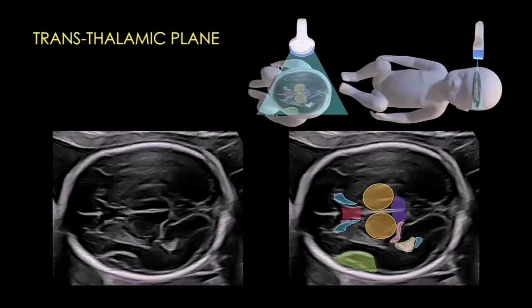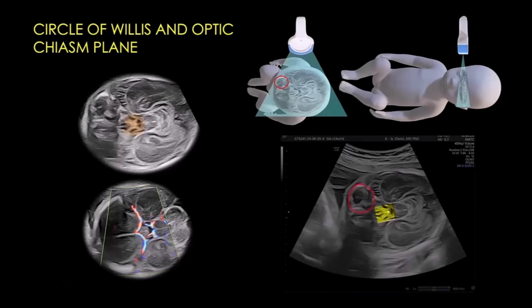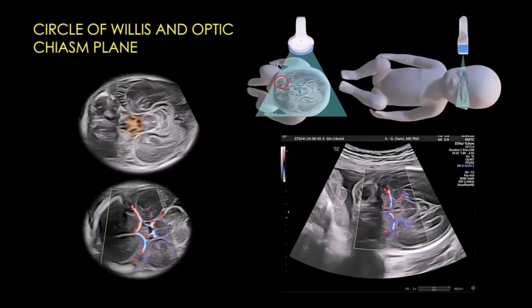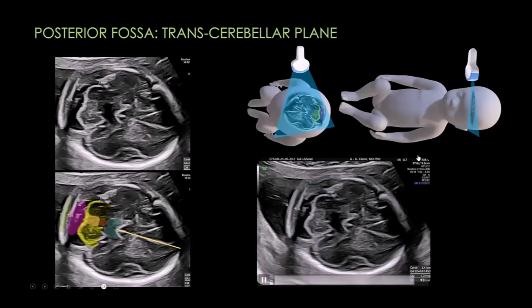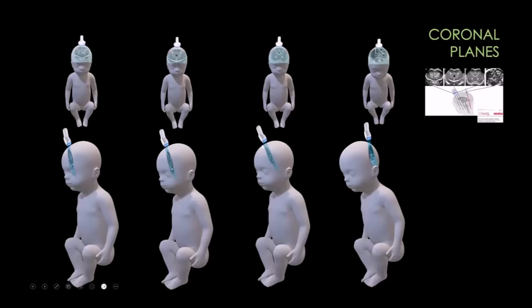We are proud to present Fetal Anomaly Scan, a comprehensive step-by-step guide to second-trimester ultrasound, a complete online course designed for clinicians and sonographers who want to strengthen their practical approach to prenatal ultrasound. This training package includes 5 structured video tutorials, guiding you through a systematic and effective evaluation of fetal anatomy during the second trimester.